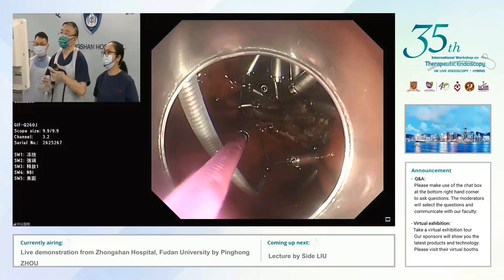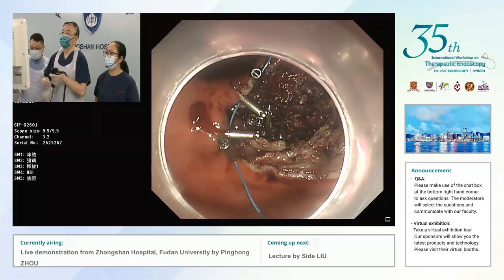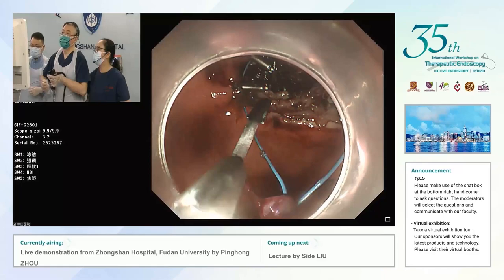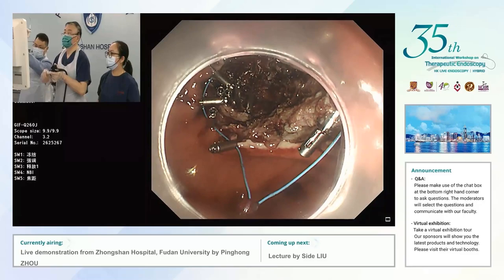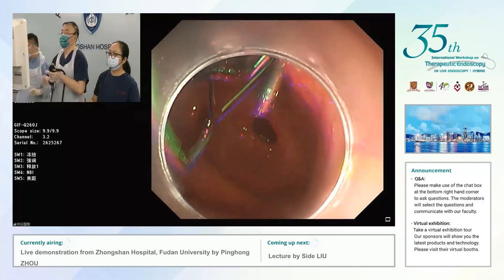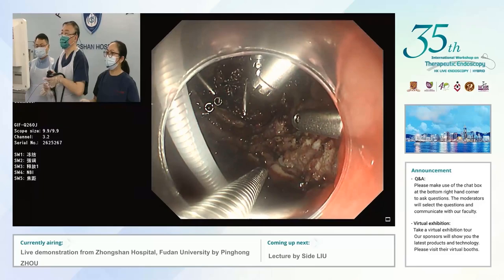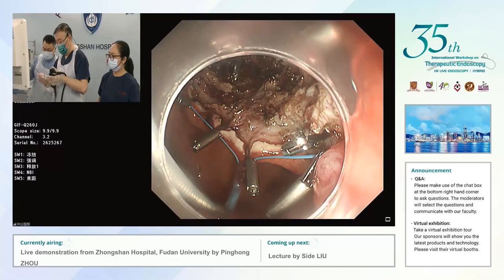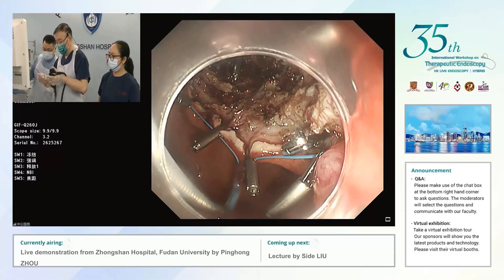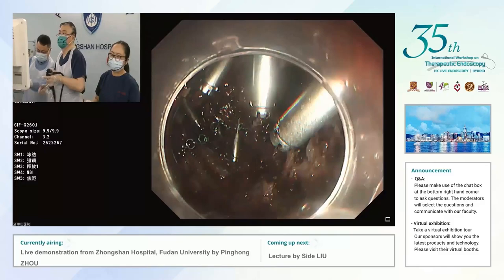This is a full-thickness resection — you can see the muscle defect. When you close it, you see the muscle fibers around the lesion. It looks not perforated but it is a full-thickness resection so we need to close it. You were seeing the subcserosal arteries and muscle fibers — not perforation as such, but it could perforate in time. Closure also reduces gastric acid exposure to the vessels. Professor Zhou is using suction to reduce the size of the defect so the loop can fit nicely.